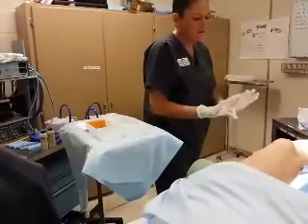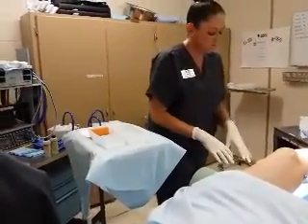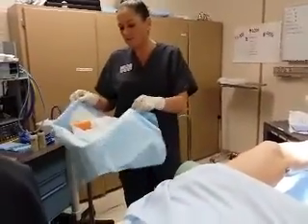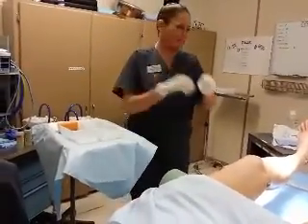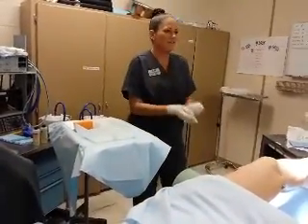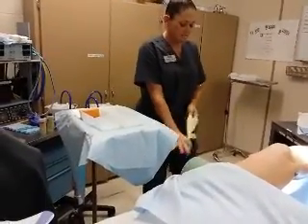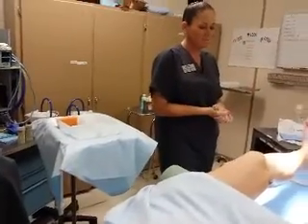At this point, I'm done putting my hand over the surgical site, so I can drop it here. I can move where I want to move. You want to pick your stuff up? I'm not going to put it in there because it's full of soap. You would put your stuff in the trash, and you would take your gloves off glove to glove. Okay, I'm done.